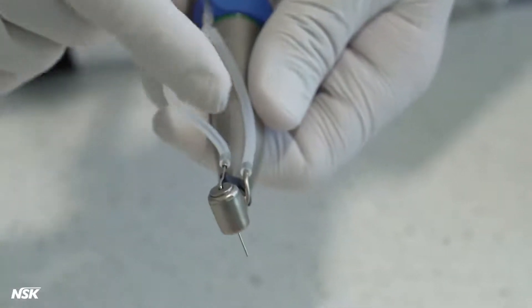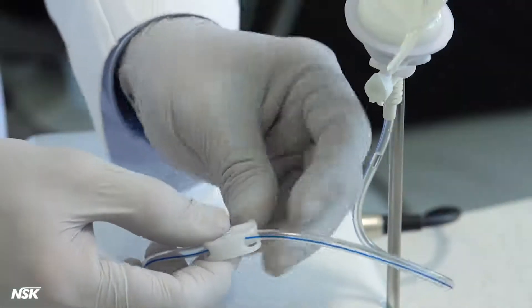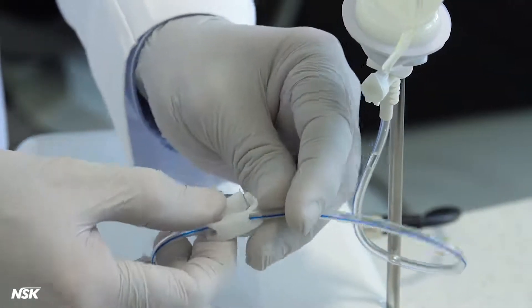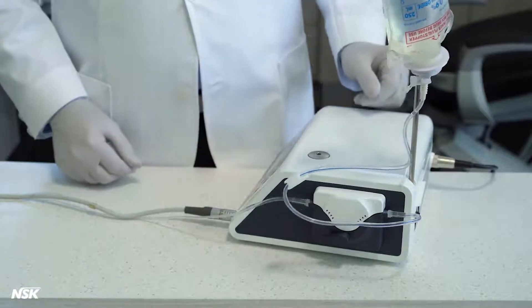This dual irrigation setup is only used in unique cases with certain drills. Open the tube clamp and the air cap. Your Surgic Pro is ready to operate.